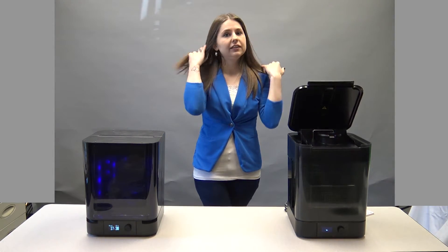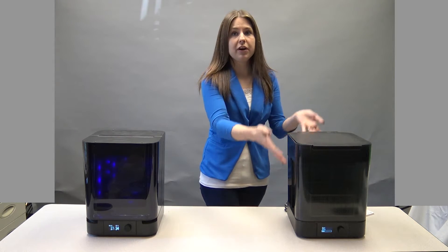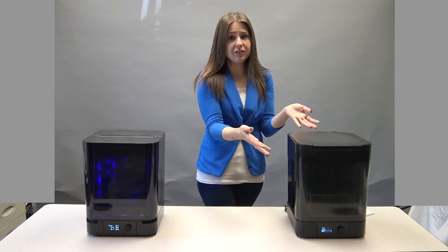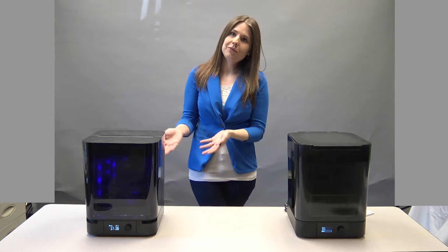You can actually leave right now — just set it and forget it. The lid will open automatically when done, so the parts won't be sitting in the isopropyl alcohol however long you're gone. When it's ready, you can move into the Form Cure.